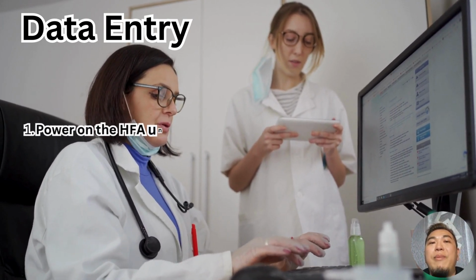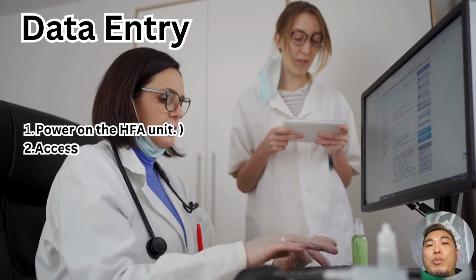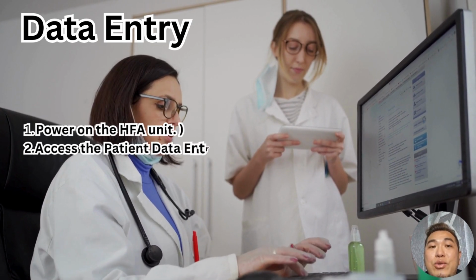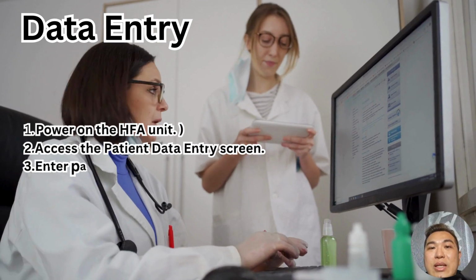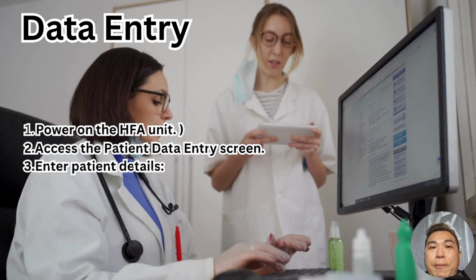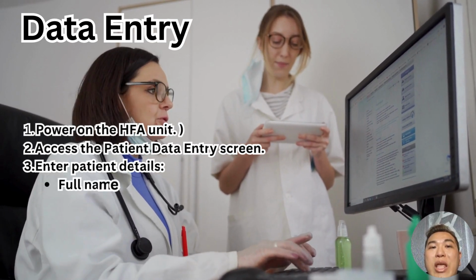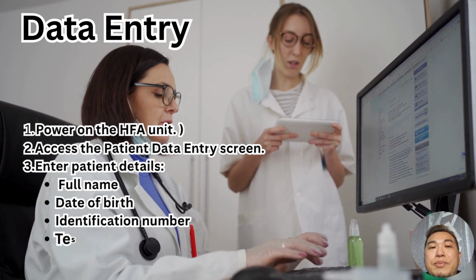I will now demonstrate what to do before starting the visual field test. After powering on the Humphrey Visual Field Analyzer, the first step is to open the patient data entry screen. Here, we input all the required patient details to ensure the results are saved and linked correctly. This includes the full name, date of birth, and identification number.